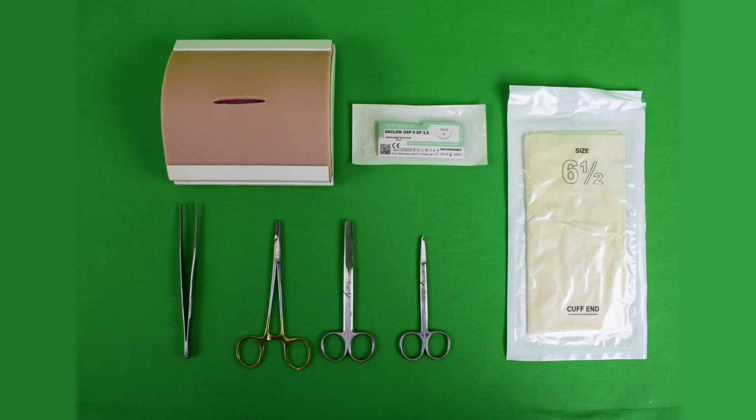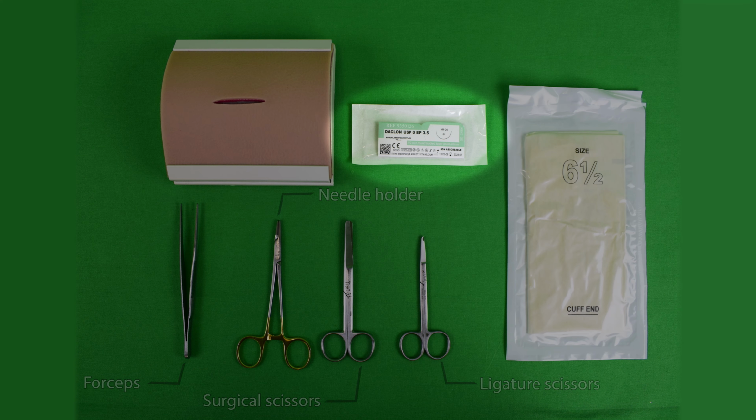Needed for this skills lab exercise are a suture pad, a needle with attached suture thread, gloves, a pair of anatomical forceps, a needle holder, a pair of surgical scissors, as well as a pair of ligature scissors. The required needle is an atraumatic suture needle without an eyelet. Instead, the thread is connected to the needle directly. This creates a smooth perforation of the skin during suturing, which is gentler on the surrounding tissue. Therefore, an atraumatic suture needle is better suited for fine, delicate tissue such as internal organs, blood vessels, or skin.